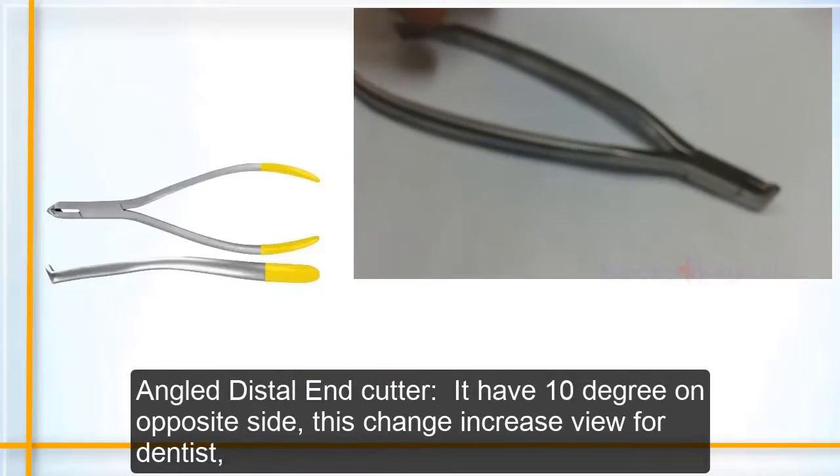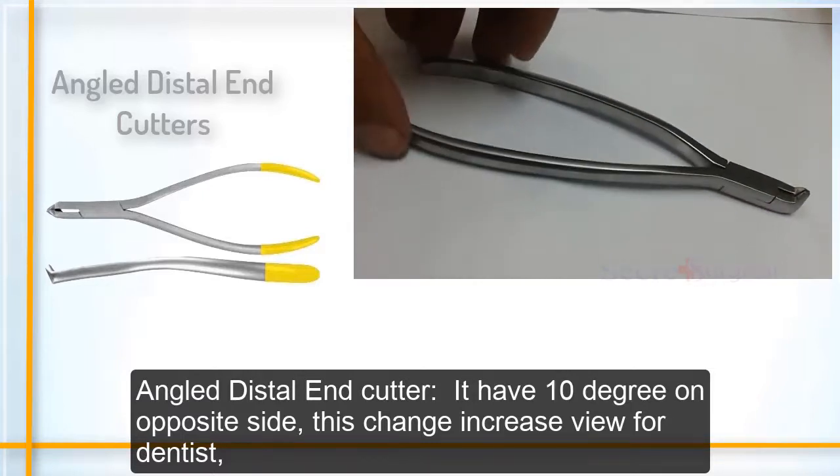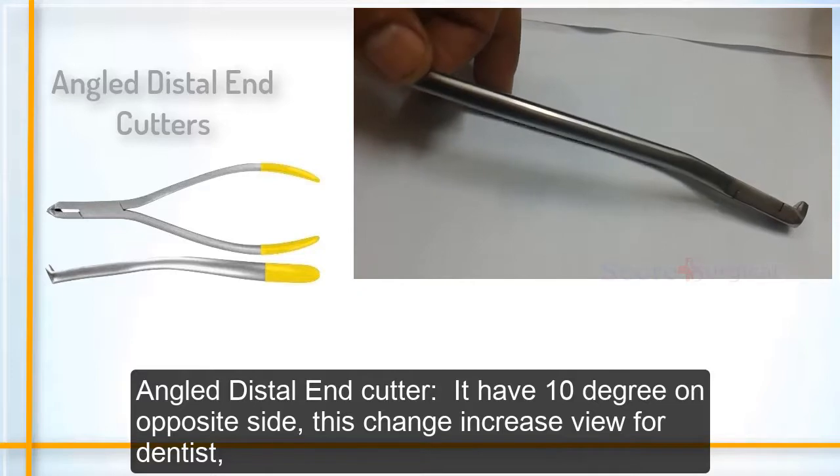The angled distal end cutter has a 10-degree angle on the opposite side. This change increases the view for the dentist.